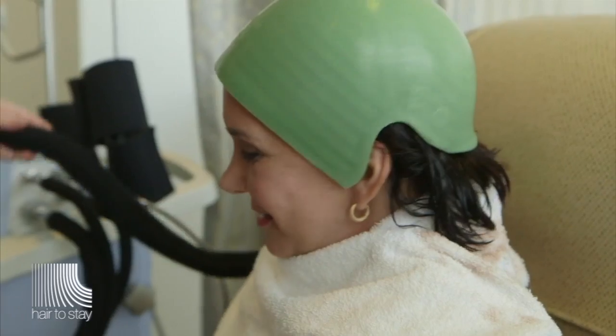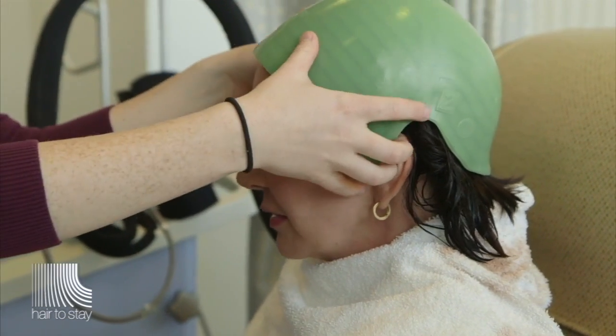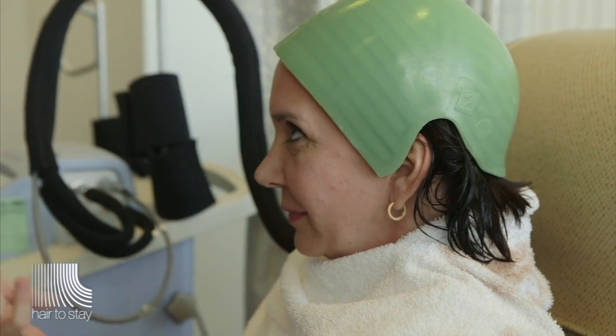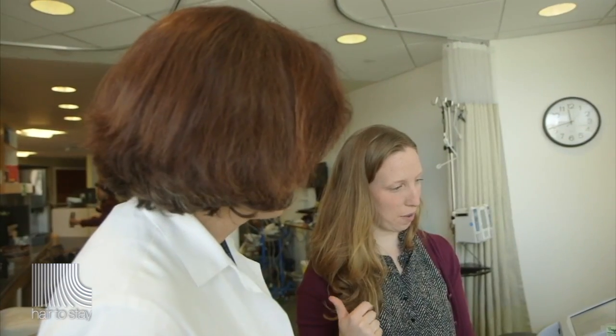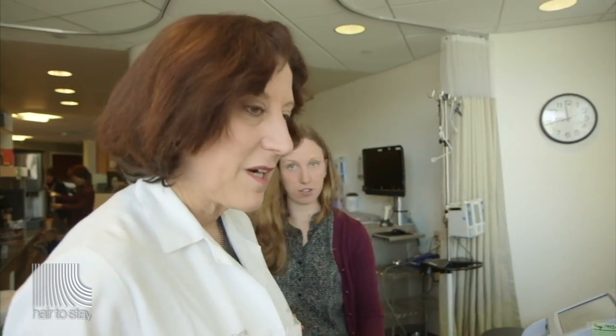The automated types of scalp cooling include a machine that has a coolant that circulates through a cap that looks like a swimming cap, connected by a long tube. For some machine types, there are temperature monitors in the front and back of the cap; others have a single temperature monitor. You put the cap on the head and then an insulating cap on top to keep it at a stable temperature.